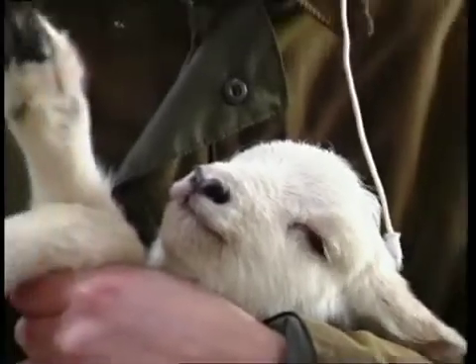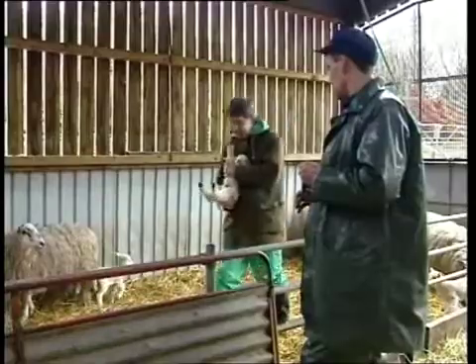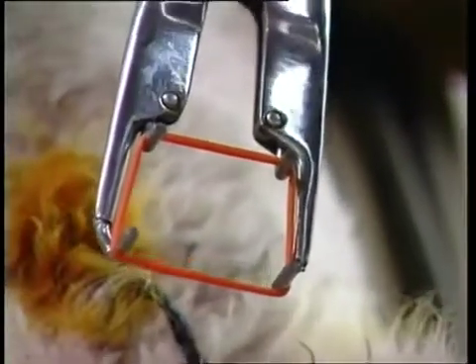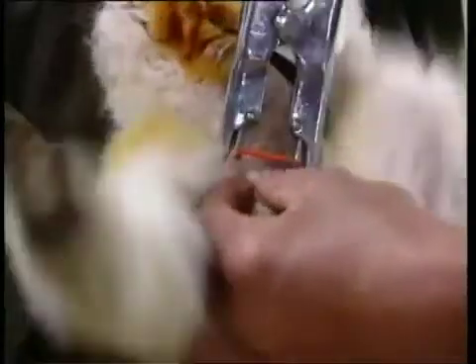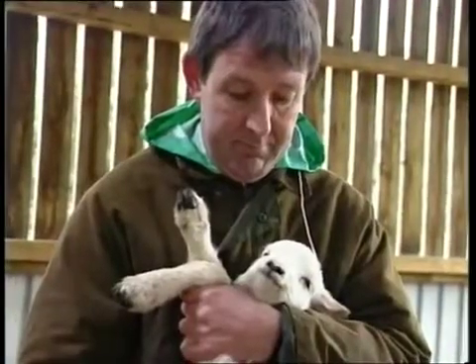It's important to hold the lamb for castration in a way that's comfortable for both lamb and shepherd. Some shepherds operate on individual lambs single-handed, while others prefer to operate on batches of lambs with an assistant on hand to hold them. Once the lamb is held securely, expand the ring on the calipers of the application tool, then place it over the scrotum and hold it against the lamb's body. Locate the testes in the scrotum and gently ease them both down to the bottom of the scrotal sac. Lower the ring into place just above the testes and below the teats, taking care not to catch the teats or any folds of skin. Finally, allow the calipers to close and extract them from the ring.